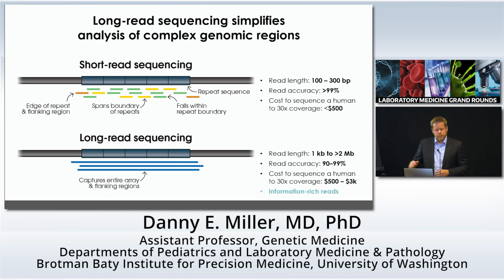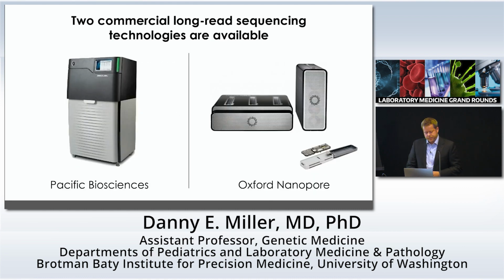But the thing that I want to drive home today is just how information rich these reads are. You can gain a lot of information from the single technology or the single data source. So commercially right now, there are 2 types of long-read sequencing options available, one from PacBio and one from Oxford Nanopore. Illumina is developing a synthetic long-read technology.